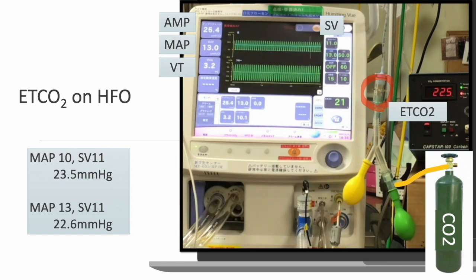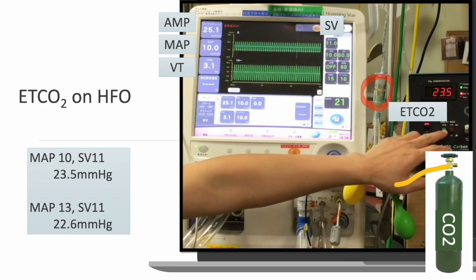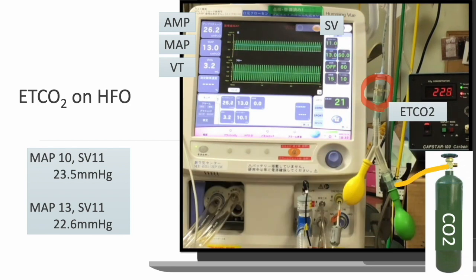In actual patients, we expect to improve oxygenation by increasing MAP, and increasing MAP also improves lung compliance. This result shows that setting MAP to an appropriate value improves oxygenation, but also improves ventilation because tidal volume improves as compliance improves. Even the slightest change in tidal volume will decrease CO2 concentration.